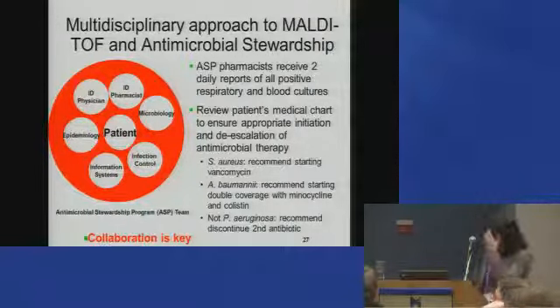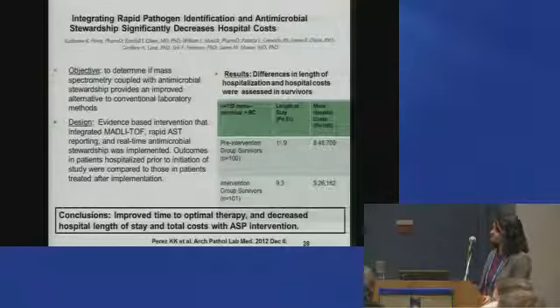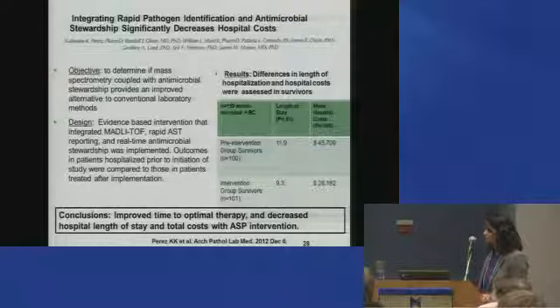Now, this very nice paper came out from the Methodist Hospital in Dr. Muss's group, where they implemented the MALDI-TOF in their lab for clinical microbiology, and they also did susceptibility testing with the BD system. And then they had a pharmacist, Dr. Perez here as the first author, and the lab would call her with blood cultures that were positive. And then it was really up to her to contact the physician and make sure that the patient was on appropriate antibiotics and so on. She did not mind being woken up in the middle of the night.